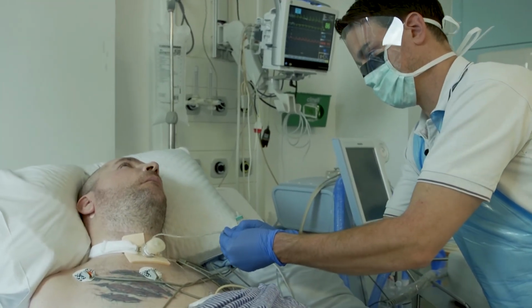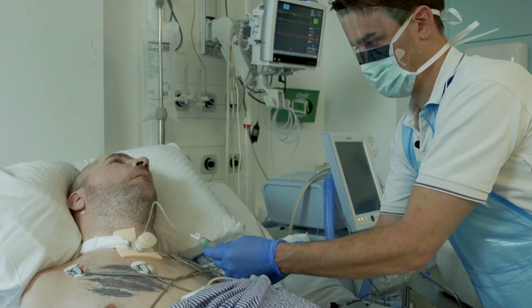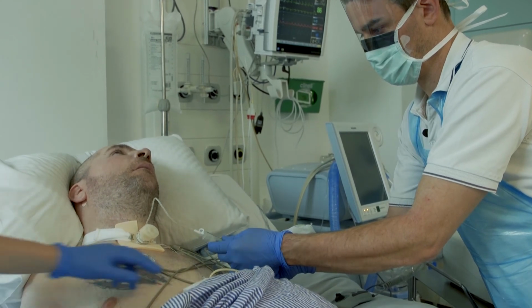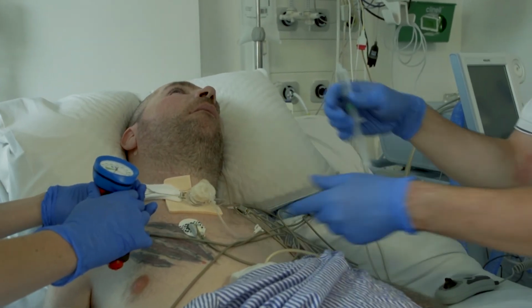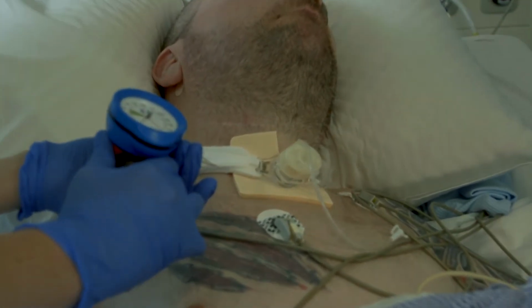Following stopping treatment, you would re-evaluate the patient in terms of volume of secretions cleared, oxygen saturations, changes on reauscultation, and patient feedback about whether they feel clear. During treatment itself, you would monitor for any adverse events, and this would trigger you to stop the treatment immediately.